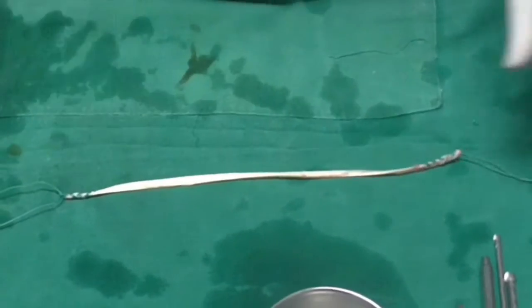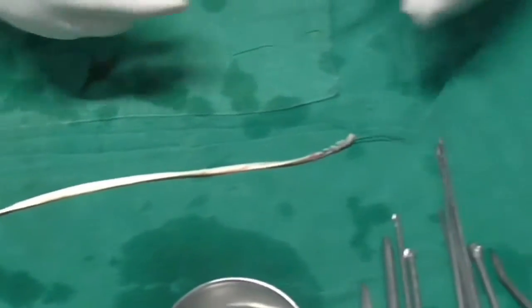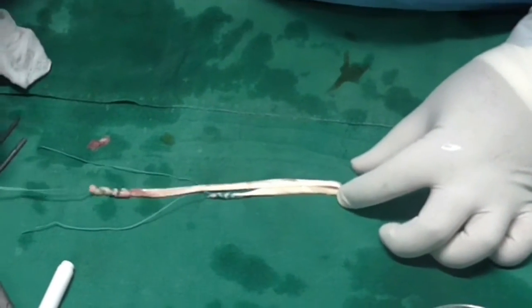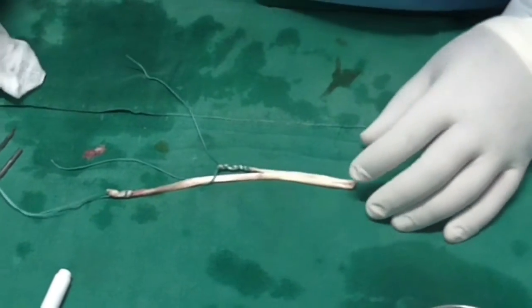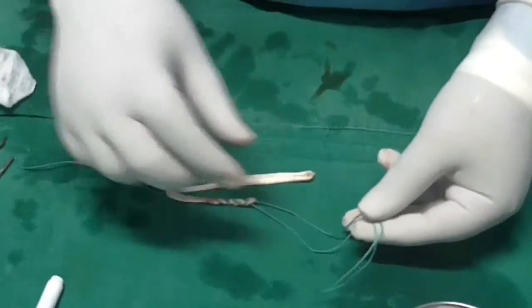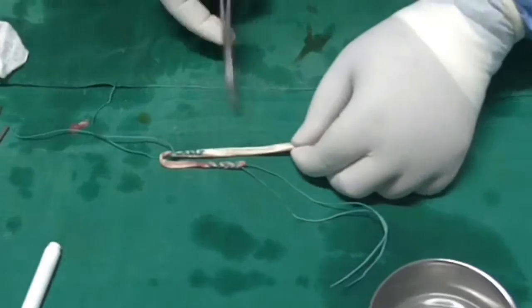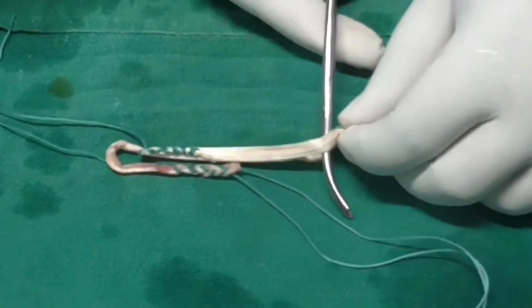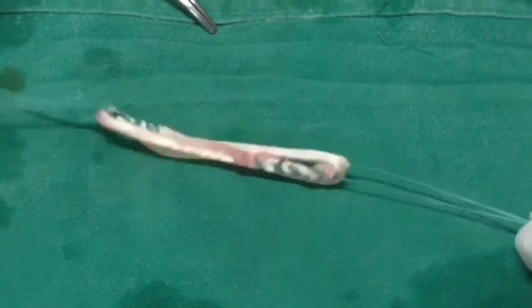We are going to demonstrate the same thing here. We have already harvested the semitendinosus and prepared it with loop stitches on either side. Then we looped it across, opened the ethibond from one edge, and brought it back. In between the loop of the graft, we take one suture away.